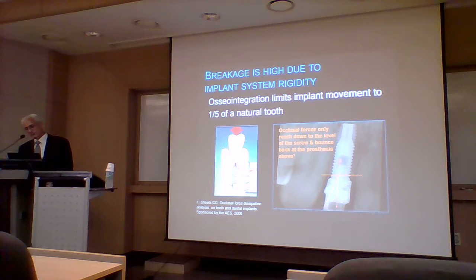So this is why the bone support is maintained, but the breakage occurs in the occlusal materials and in the abutments and in the screws, things that are above the bone level.